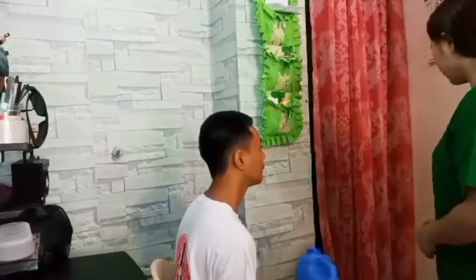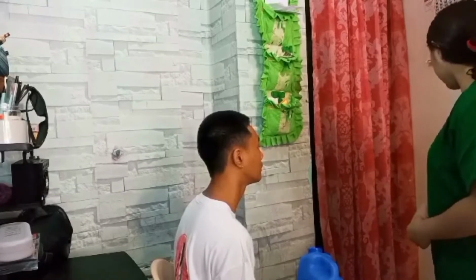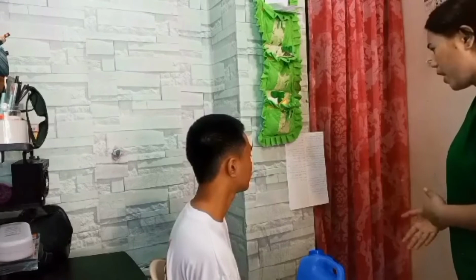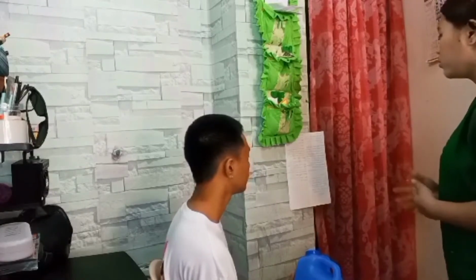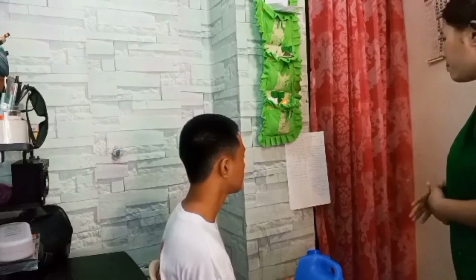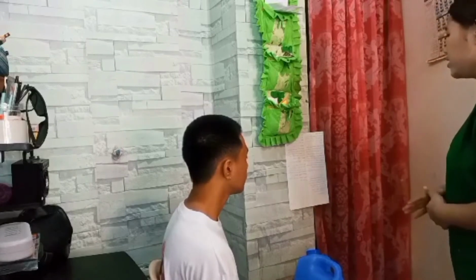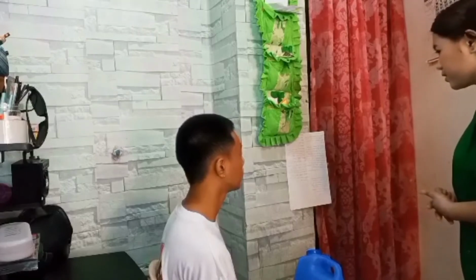What if I have to go out, or I have some errands to do? Well, actually, you have to bring the container with you, or you would do it on a day where you don't have other activities going on. The important thing to remember is that you need to collect it for 24 hours and the container needs to be refrigerated. Do I make myself clear, sir?